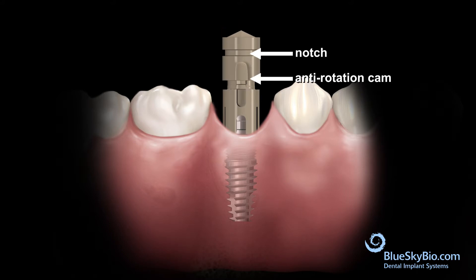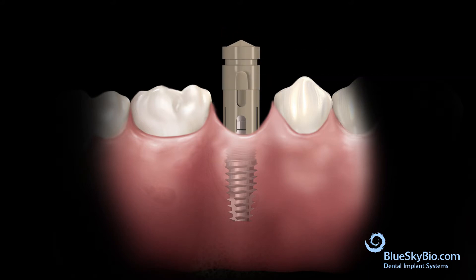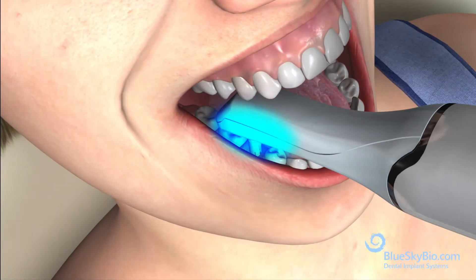A scan body is seated fully on top of the Rosetta adapter with firm pressure. Scan the area with the optical scanner.